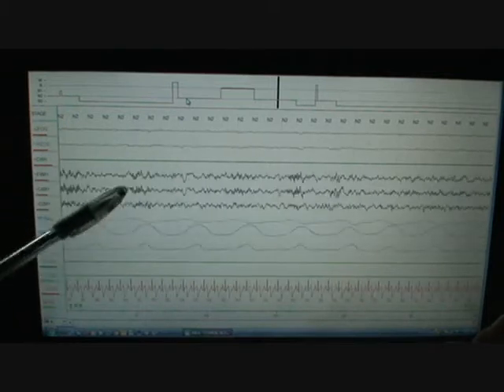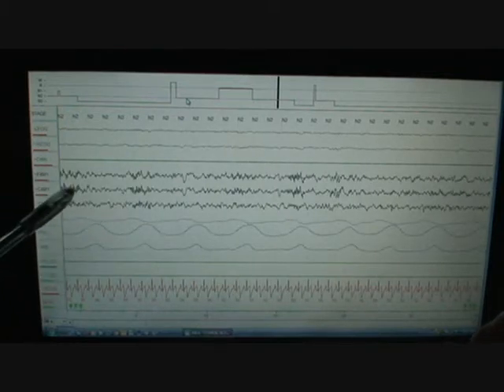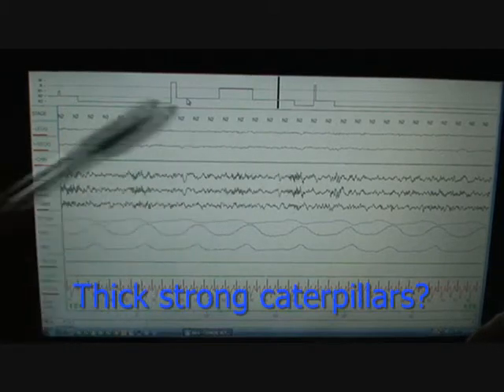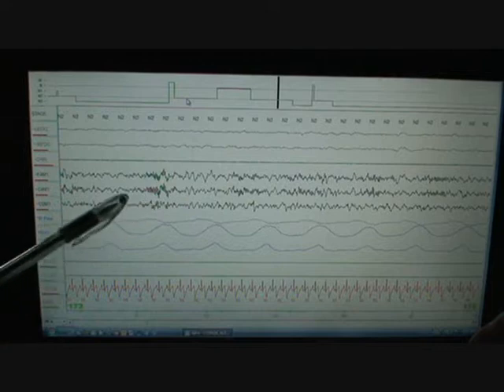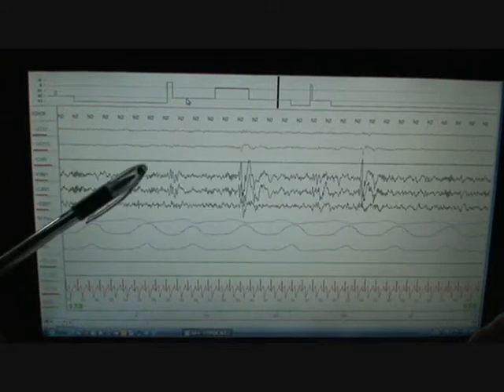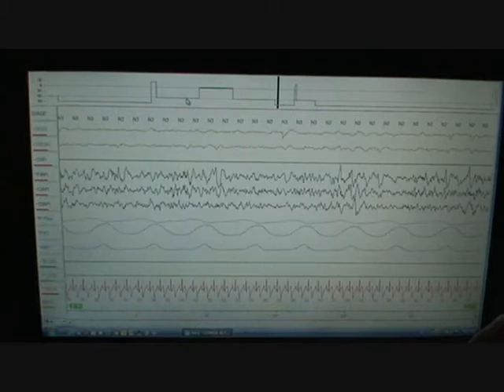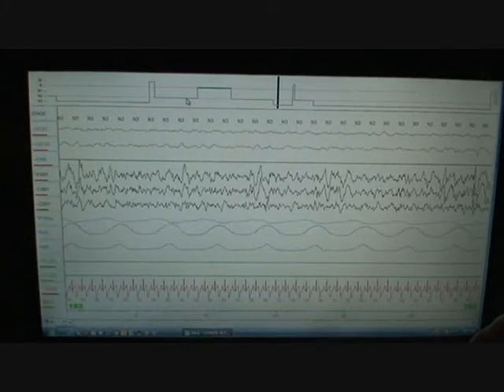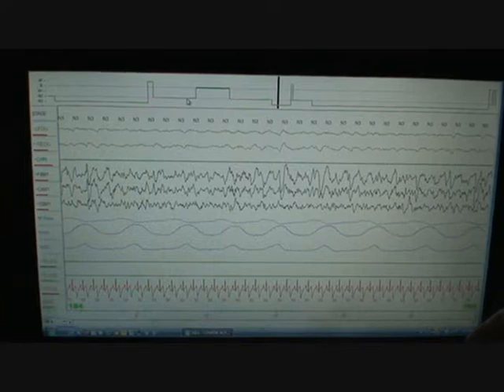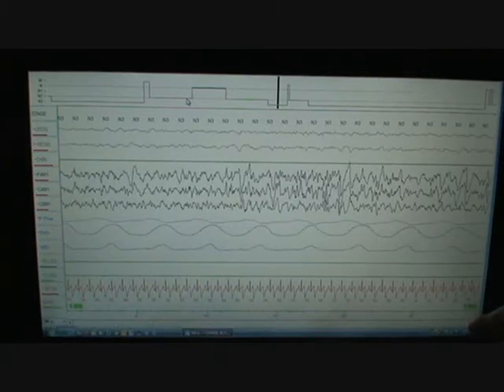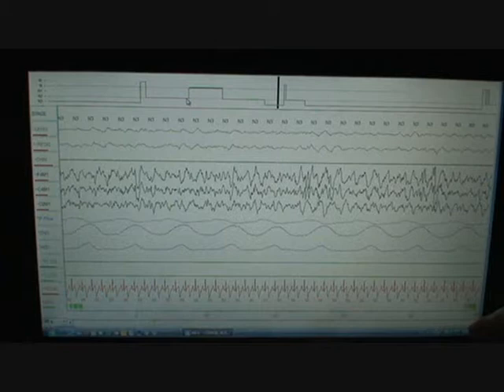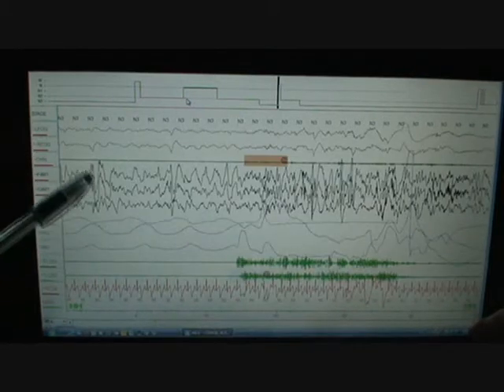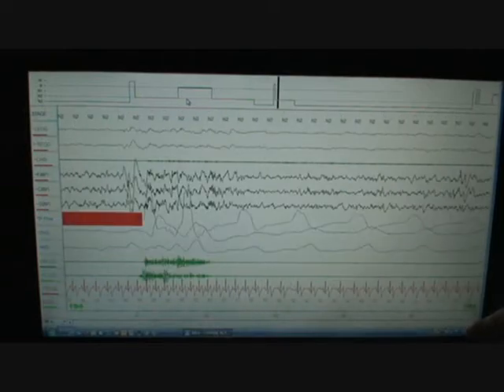Anyway, you can see the person just transitions back into stage two. We see some very, very strong sleep spindles here. Those are nice thick ones. They look like caterpillars going across the page. There's a huge one. You can see them in all channels. This person's young, so you can see their sleep is really pretty good. They're back into delta sleep. If you're an adult and you're worried that you don't have a lot of delta, don't be. Delta is when growth hormone is released. And since no offense, you're no longer young anymore, you're not going to be producing nearly as much. So this is very strong delta. That's why they call them the waves of youth.